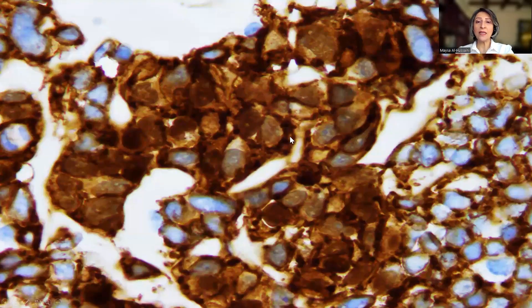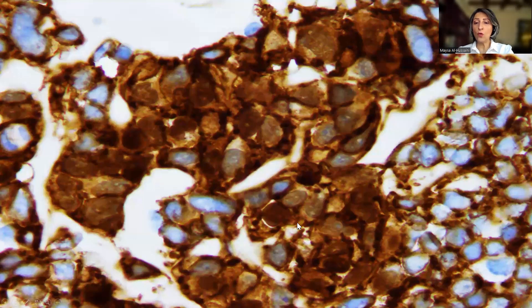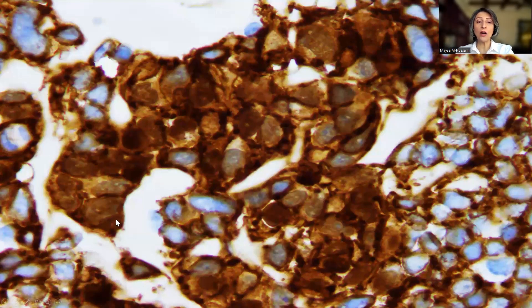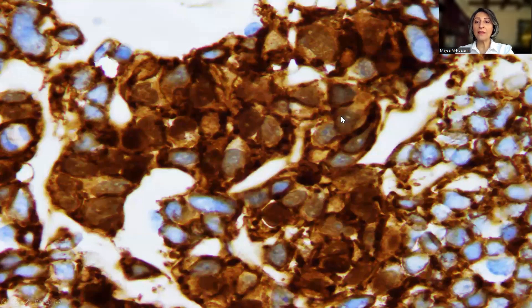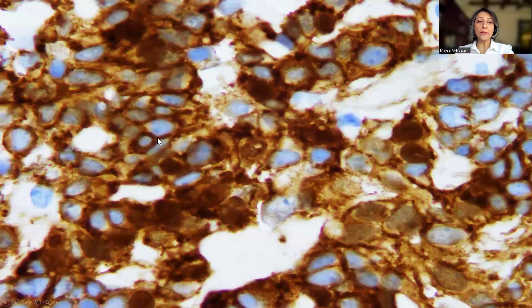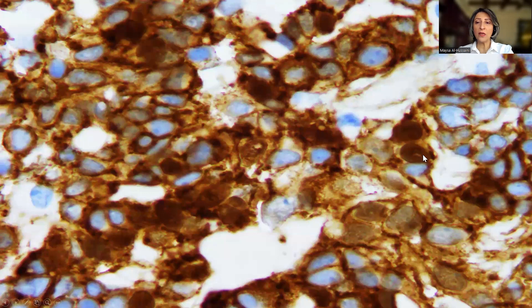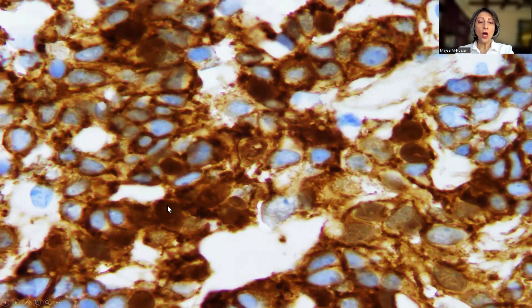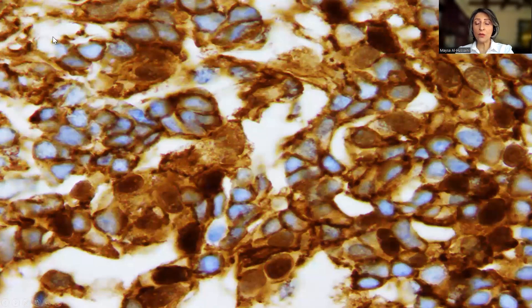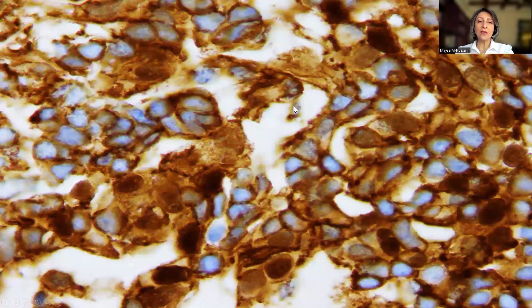So this is another focus. Again, these are the nuclei which are negative, and all the rounded nuclei here are the ones which are positive for beta-catenin, even the lighter colored ones. And this is a third photo — here beautifully, these are the nuclei of the cells. And the last is this beautiful image where we have a mosaic pattern of staining.